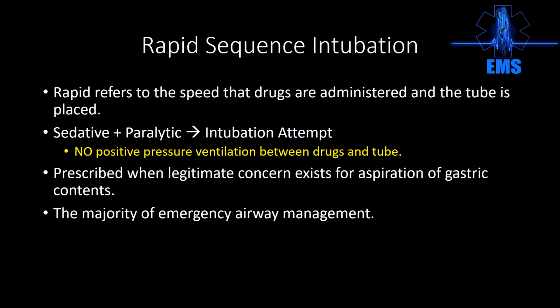So we do not need to rush this procedure. Rapid refers to how fast and in what sequence we give medications. Rapid refers to induction or a sedative, followed by a paralytic, followed by an intubation attempt with no positive pressure, i.e. no bagging, no attempts at bagging in between.